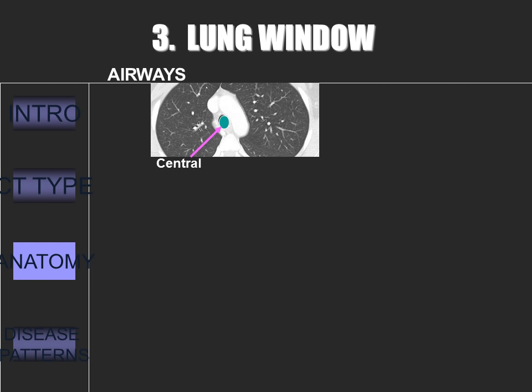Now we come to the most important window — the lung window. In this window, air appears black, aerated lung dark grey, and other structures white. There is an approach to looking at the anatomy here. First, we'll look at the airways. Look at the trachea and the central airways — is it patent? Are there secretions? Is it rounded? If it's rounded, it means that the patient has taken an adequate inspiration. If not, you'll have to question an inadequate inspiration or perhaps an expiration.